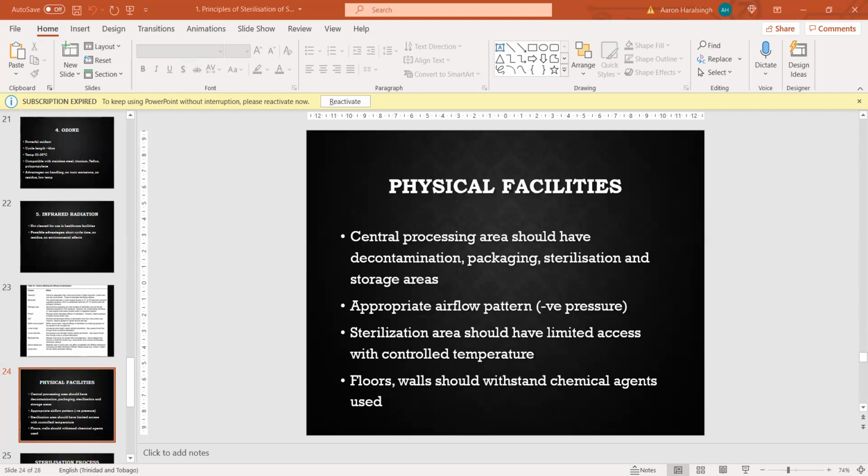So usually gauze sponge moistened with water and with disinfectants is used to remove any debris, dirt, blood, etc. And it is in that decontamination area where those soiled items are decontaminated and cleaned. Yeah.